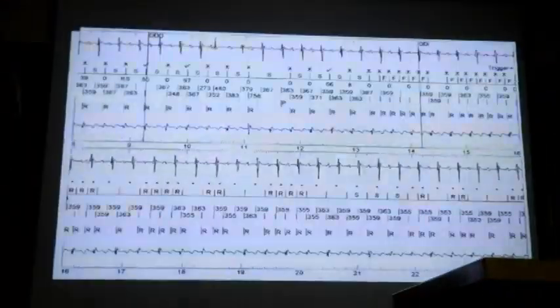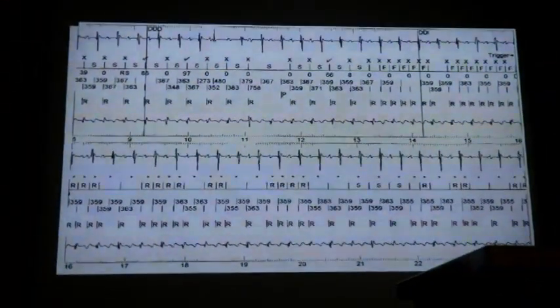And all the time I would measure the R wave, measure R wave, measure R wave. As his heart rate came up, his R wave was doing this. At about 160, it hit the point at which it started to pick up his T waves.